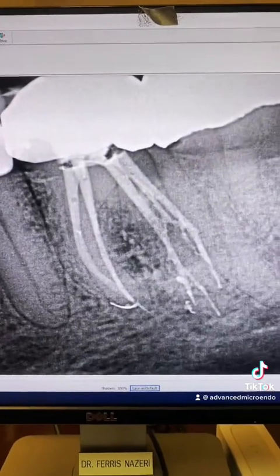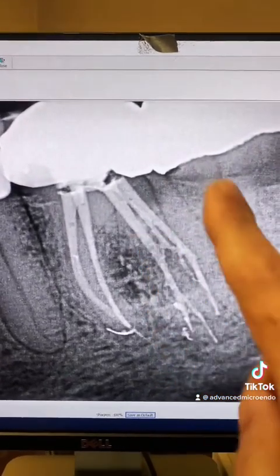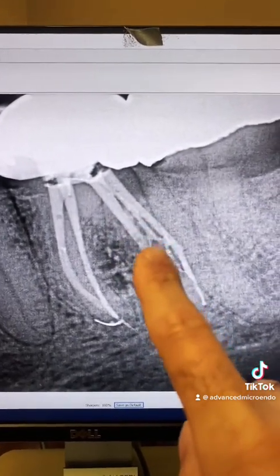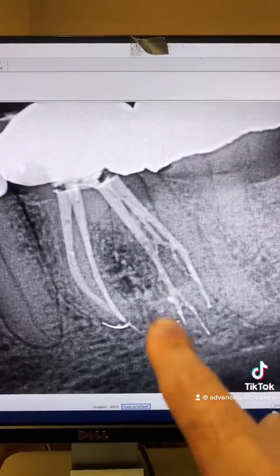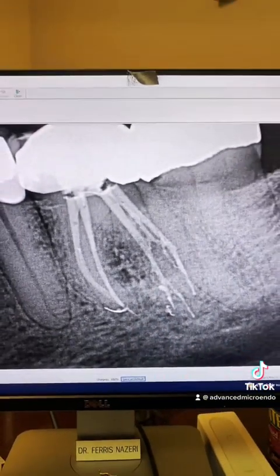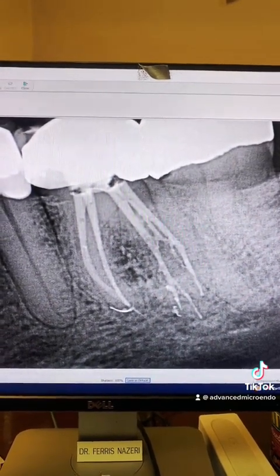This is another angulation again. Look at the distal roots. Look at the anatomy there. Just so much anatomy that we were able to clean and pick up. Look at that. Anastomosis, loops, laterals, bifurcations, trifurcations. Excellent, excellent. We went ahead and temporized the tooth and referred the patient back to his dentist for the permanent restoration.